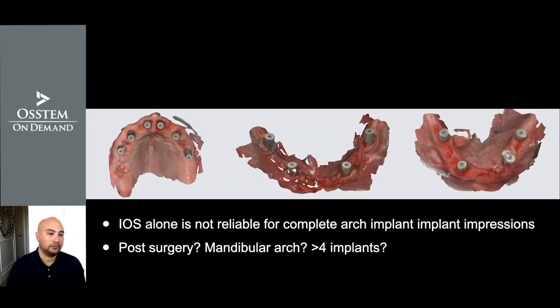In my clinical experience, I think that intraoral scanning alone is not really reliable for complete arch implant impressions. Because what about scanning more than 4 implants? How about in post-surgery situations, and also in the mandibular arch?